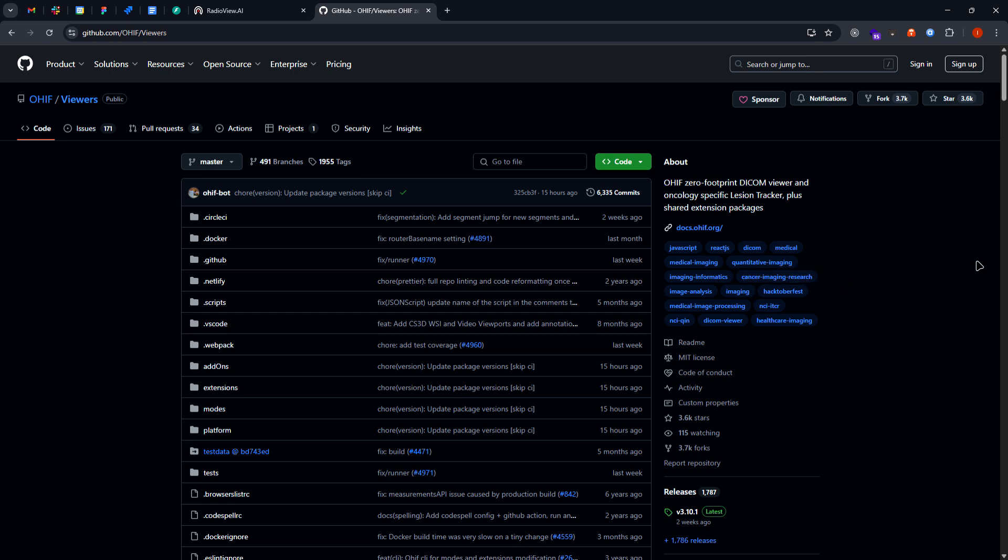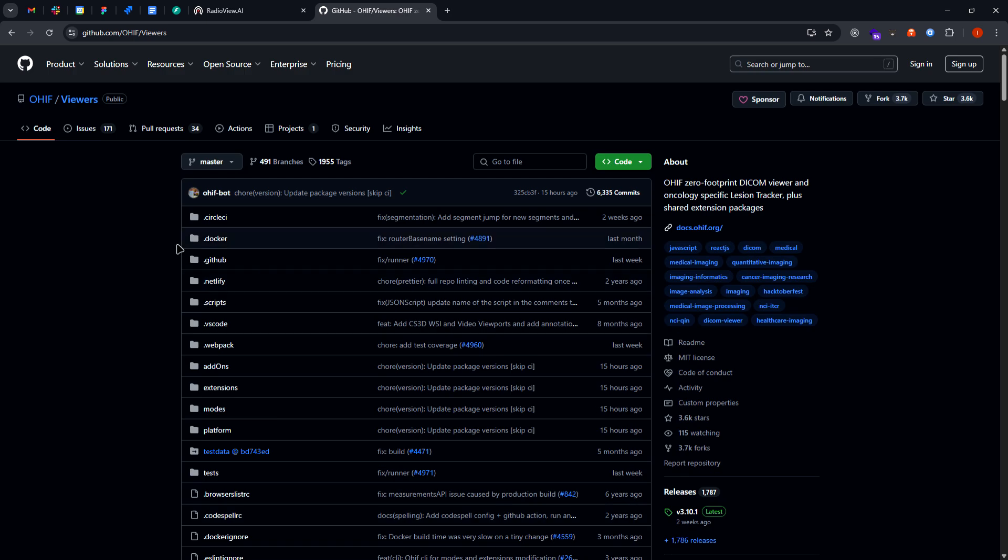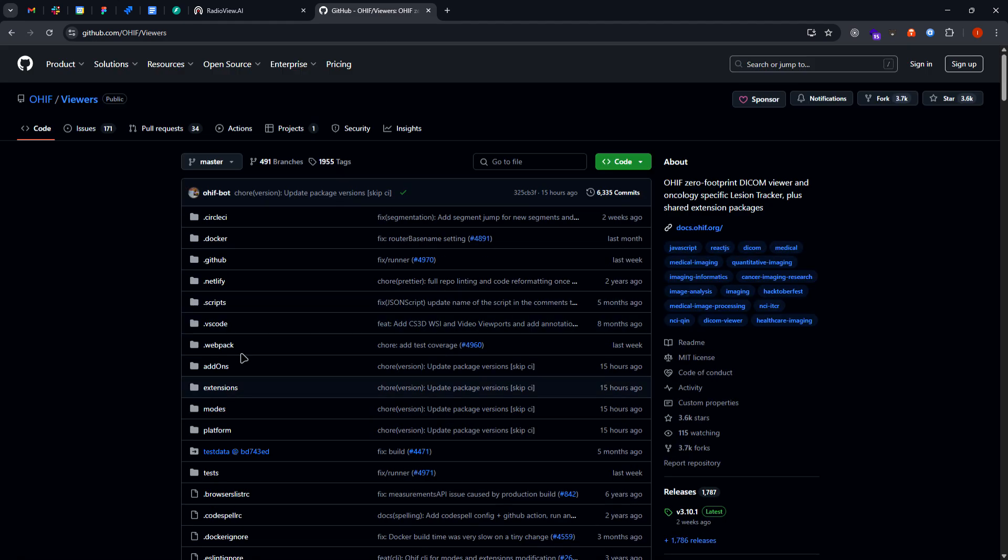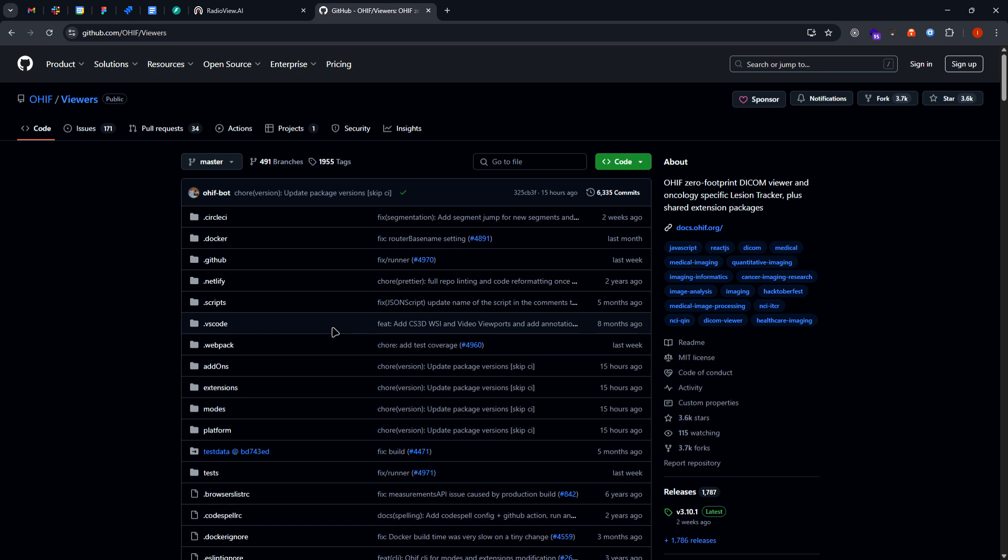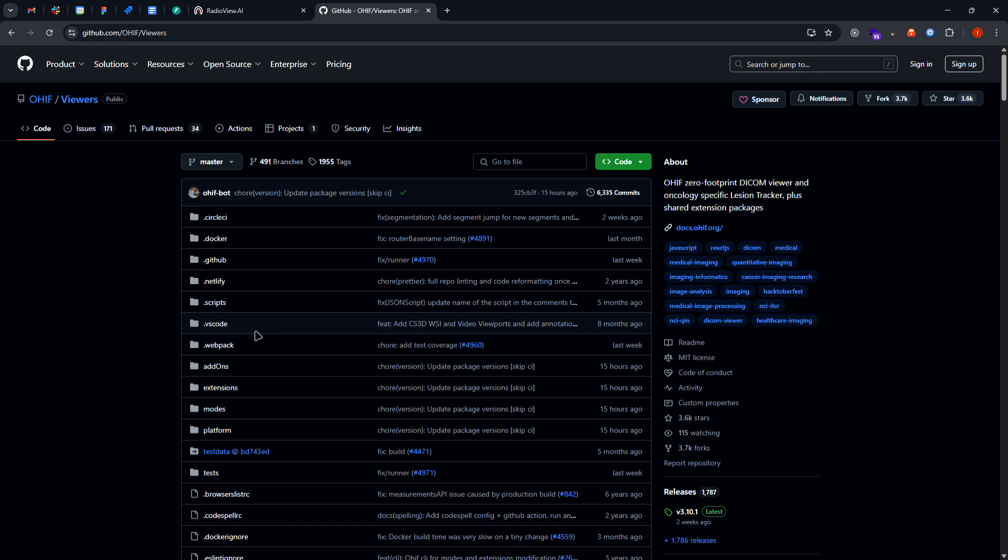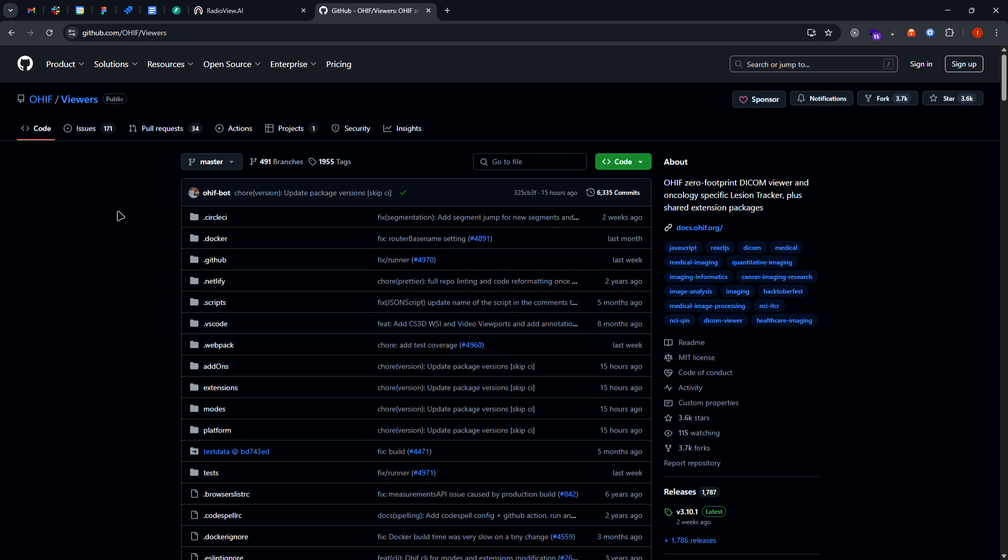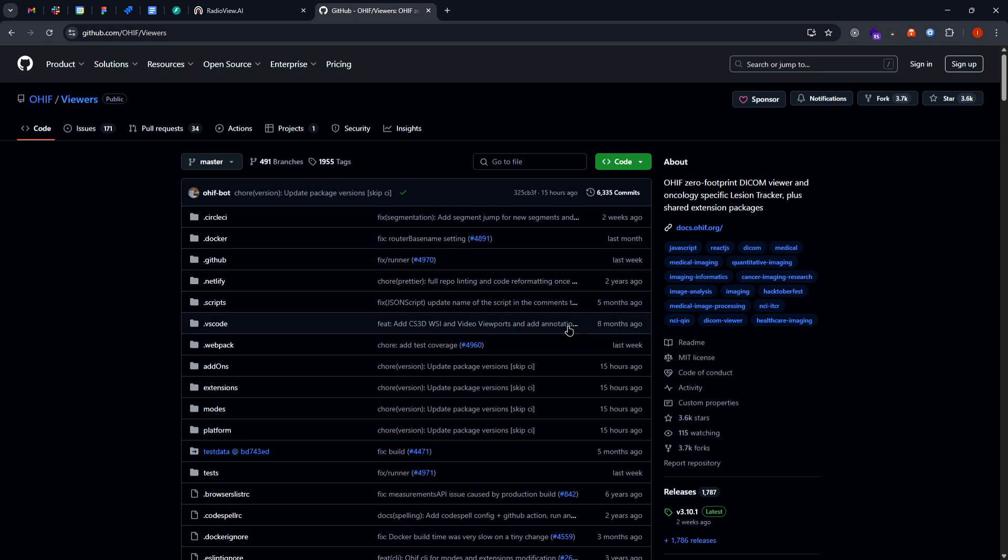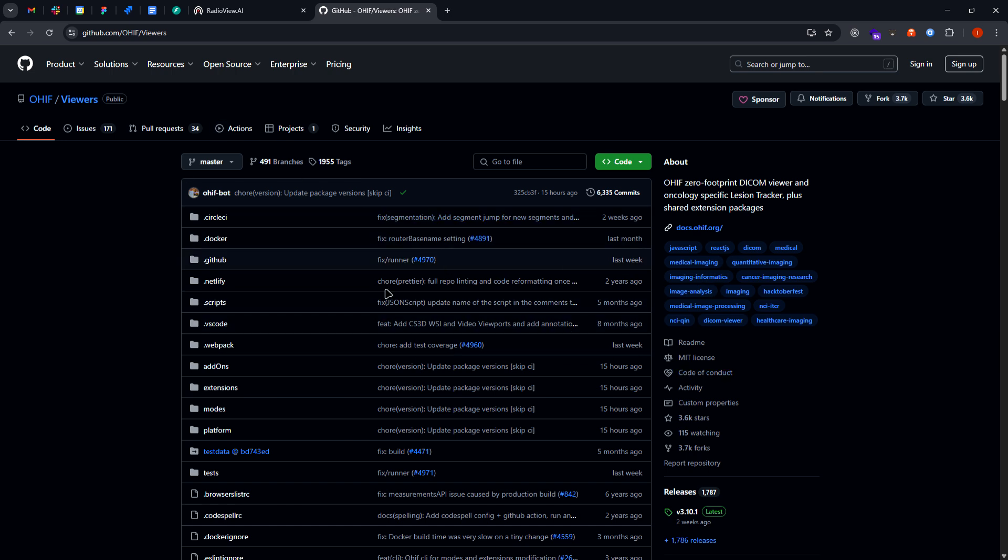So how we have managed to do so is we cloned the repo and set up the OHIF viewer with our DICOM server with ORTHANC remote ORTHANC, and from that ORTHANC we are getting the metadata for each of the DICOM images.